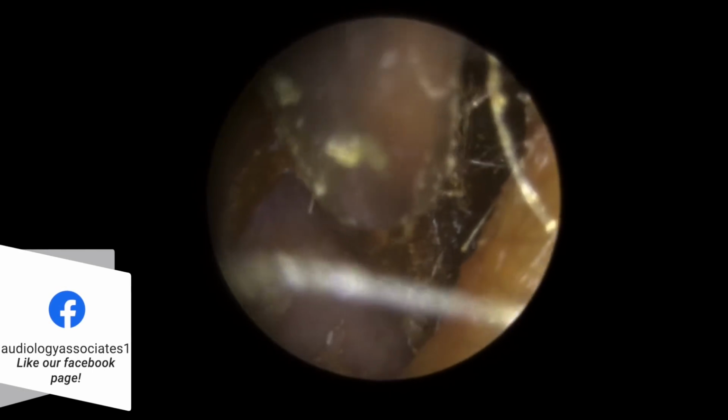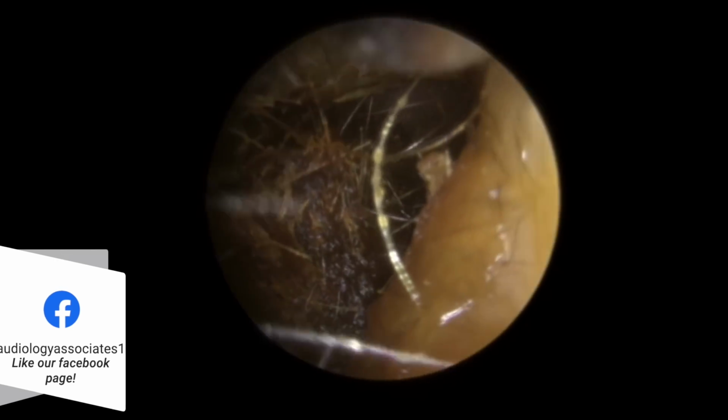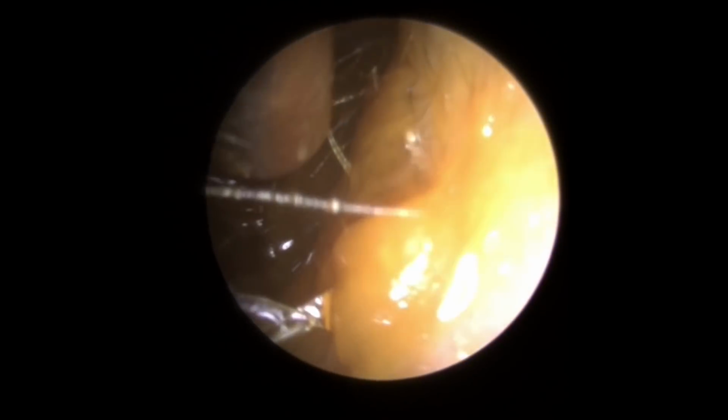So what you can see is the wax is starting to get sucked into the canal here and just peeling away from this left hand side. Wax itself is really thick and sticky, so we've got a good grip on the outside edge here. It's starting to draw the wax down the canal, but as you can see, it's very, very sticky stuff. So it's just binding a little bit to the canal wall there. So what I'm going to do is take the Zollner tube out, introduce a little bit of olive oil, which, if you've watched any of our previous videos, does help to stop the stickiness to the canal wall and the wax itself. So we're just bringing this out.